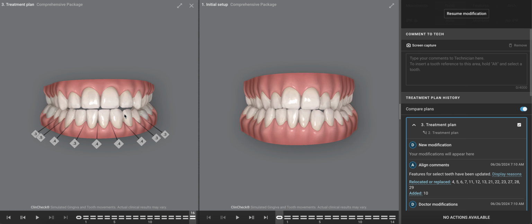In other words, there might be a lot of modifications in the end that her quote-unquote friends might not have. So I always try to set the stage for the end game of the process, rather than just having Invisalign. You're having Invisalign, which is a tool in the context of a much greater case.